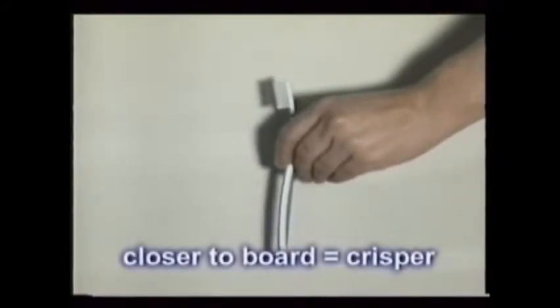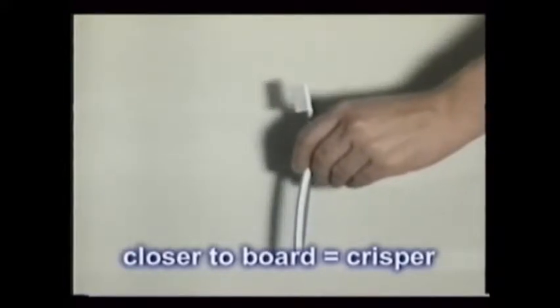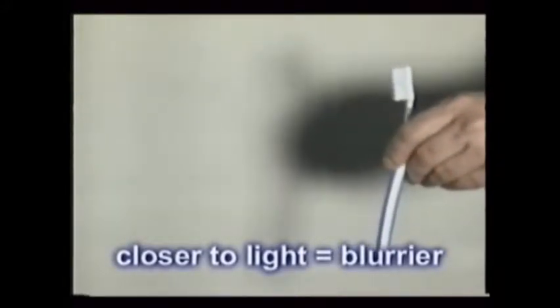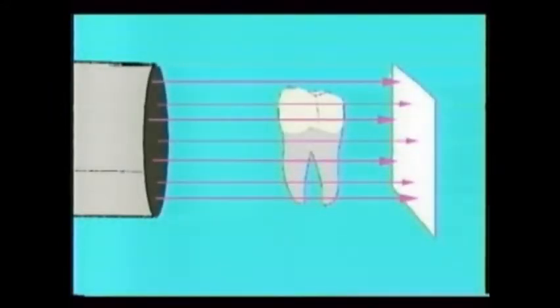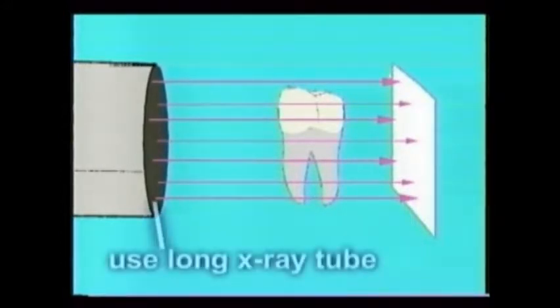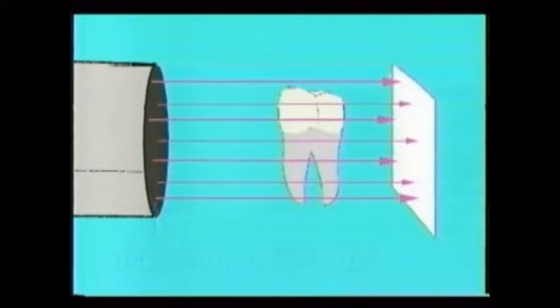The closer the toothbrush is to the board, the crisper the shadow. The closer the toothbrush to the light, the blurrier the shadow, and plus it gets magnified even more. This tells us two goals we want to keep in mind when we make great X-rays. Number one, keep the film as close to the teeth as you can. And number two, use the longest X-ray tube or positioning device to help keep the X-ray source as far away from the teeth as possible.